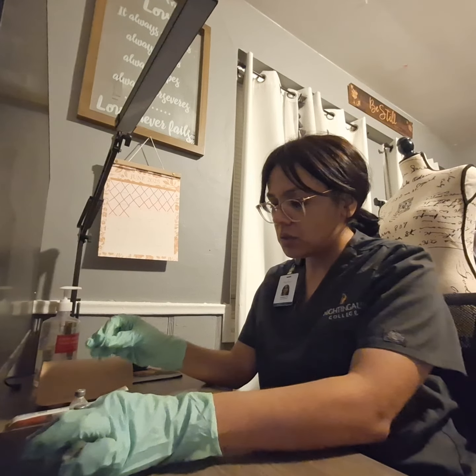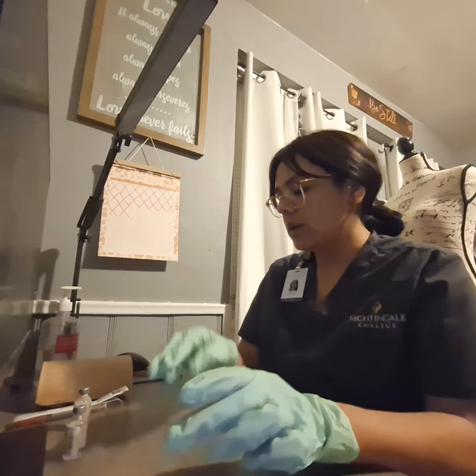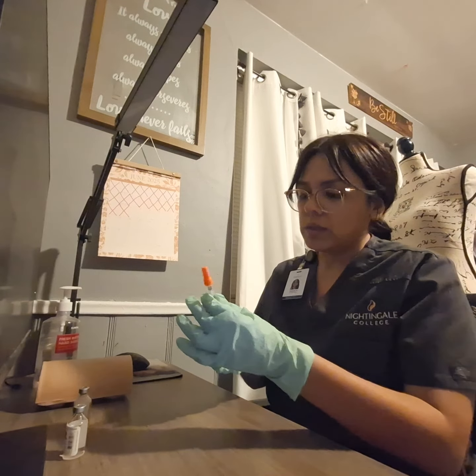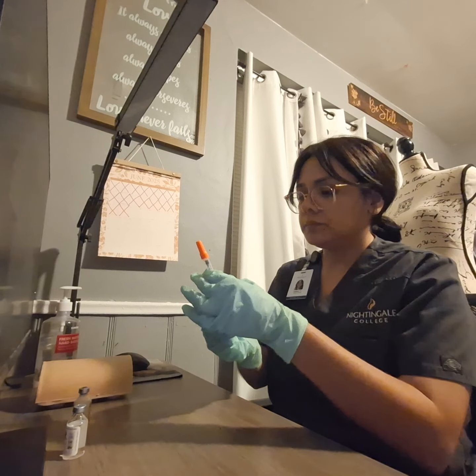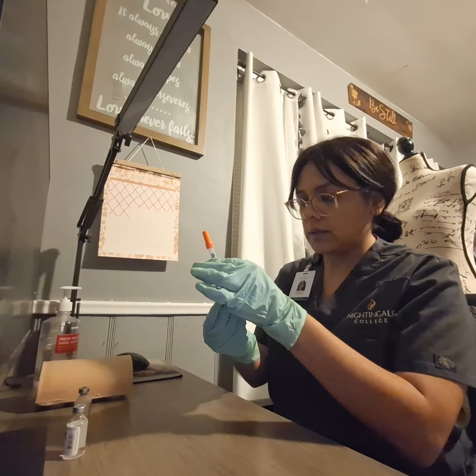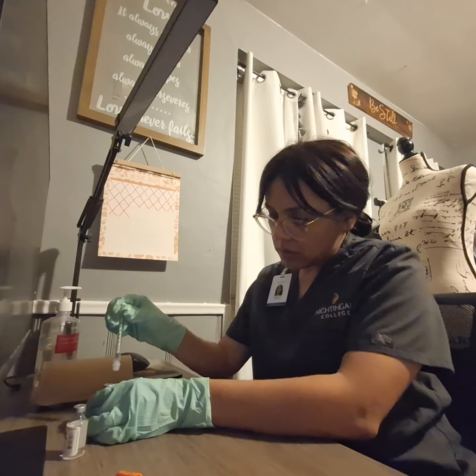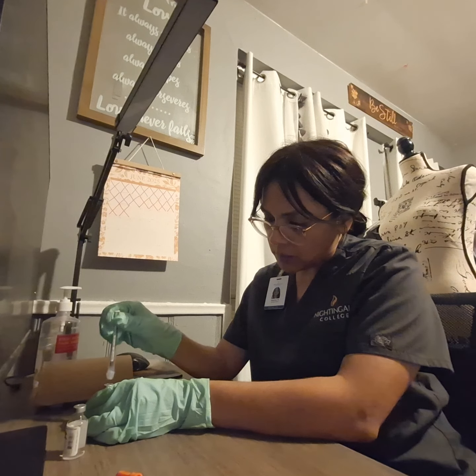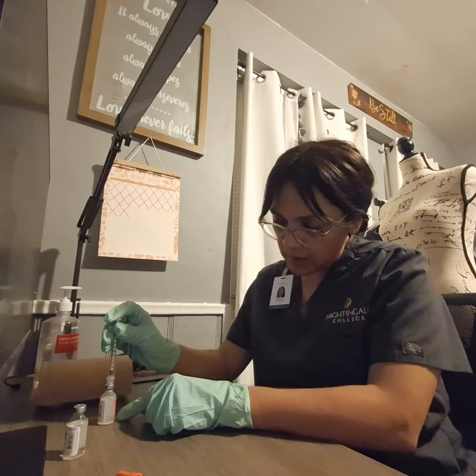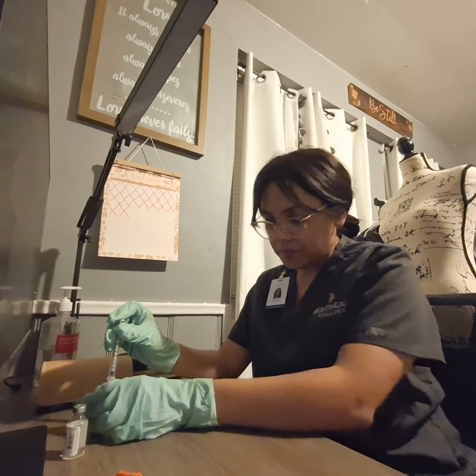Clean the NPH. I'll take the 1 ml insulin syringe here from the packaging. I'll withdraw 8 units of air. 5, 6, 7, 8. I'll uncap this carefully. I'll inject the air to the NPH, making sure that we don't touch the fluid insulin medication in there. At this time, we're not going to be withdrawing anything.